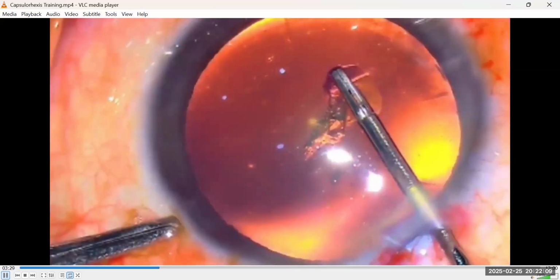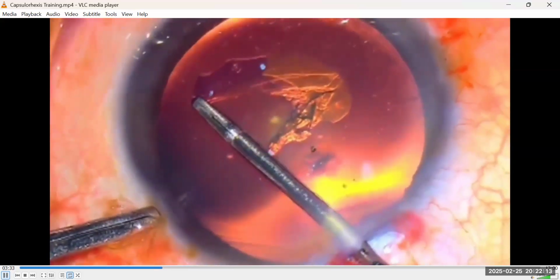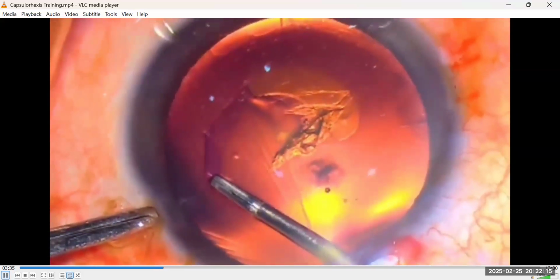So make a puncture, nudge out a flap that is visible enough for you to hold firmly, grab the flap, confirm it is firmly held up in your instrument, and advance it to the desired perimetry before one starts circumferential pull. So I've reached my desired perimetry, then I'll stop. All right.